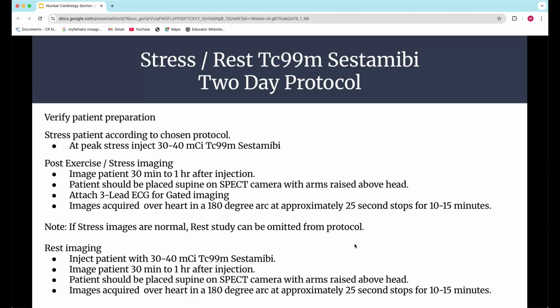So even though your patient calms down for an hour, it doesn't matter. The cardiolite is locked into that mitochondria where it existed during stress. So it's going to show up that same way. You could image them 2 hours later. I mean, obviously, the longer you go out, your counts go down because of decay, but it's going to lock in place where that time is at.